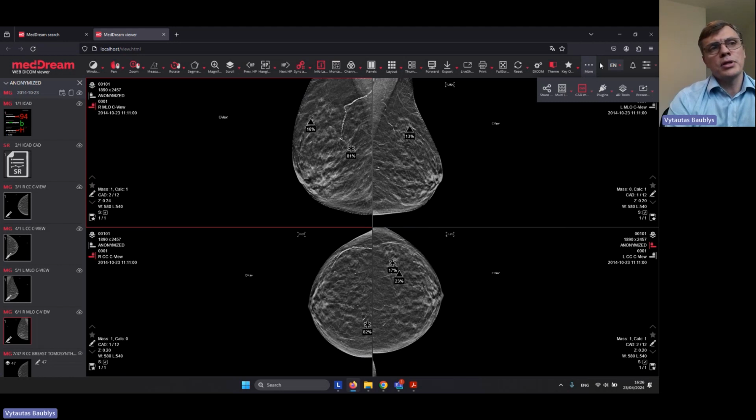Also for those users who use non-medical screens, like myself now on this presentation, my resolution is too small. So some icons are hidden under an icon, and I can extend and see them. So now I am disabling the CADs. As you see, now I have a clear view of the image, and whenever I need, I can bring them back and show them again.